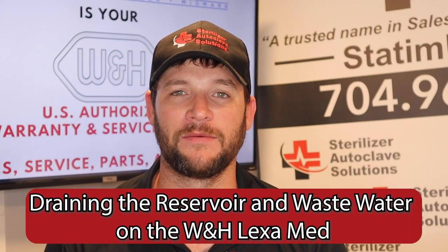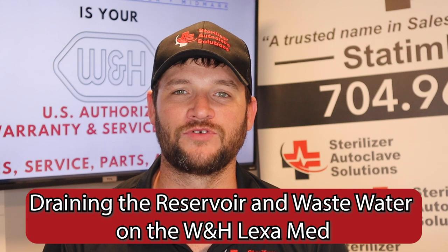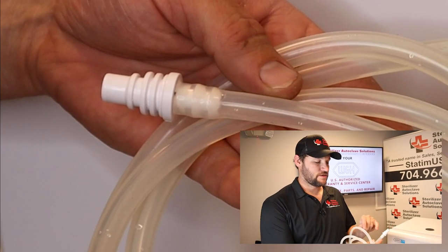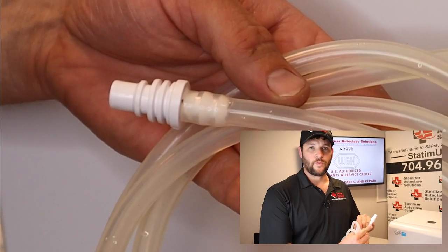Hi, this is Ian with Sterilizer Autoclave Solutions and today we are talking about the W&H Lexa and how to drain the reservoir as well as the wastewater tank. The drain tube for the W&H Lexa has an easy to use quick connect fitting. The water in your clean water reservoir should be drained on a weekly basis, which will help prevent biofilm buildup.